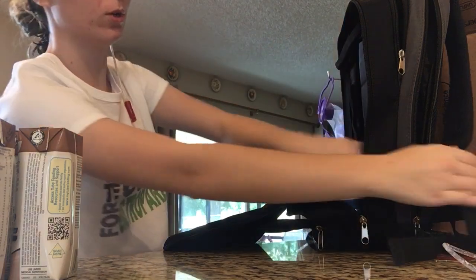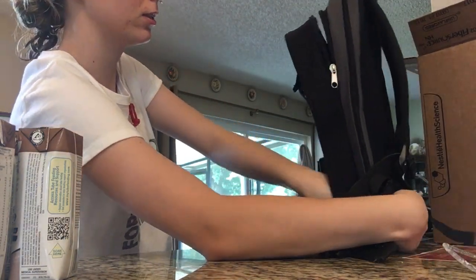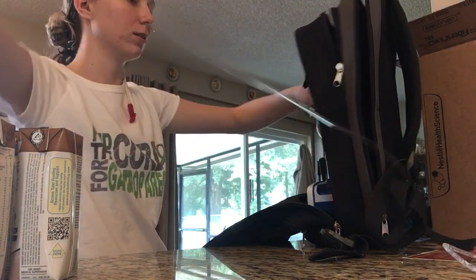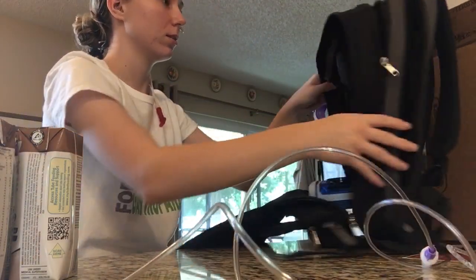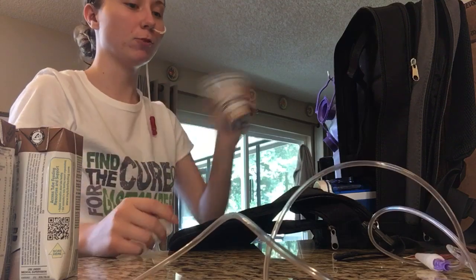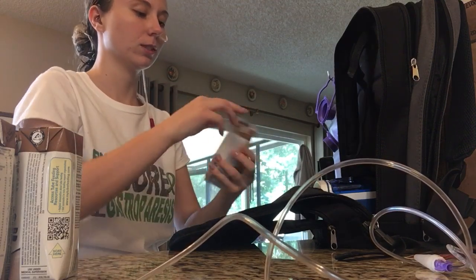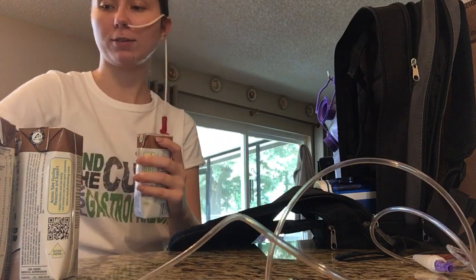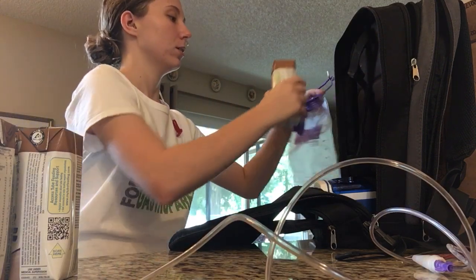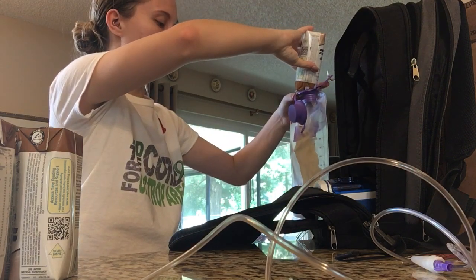I take my cord and put it through my backpack. Then I'm going to take my formula and shake it up. Make sure you shake it really well to get any clumps out that might have formed. And then I just start pouring it in.